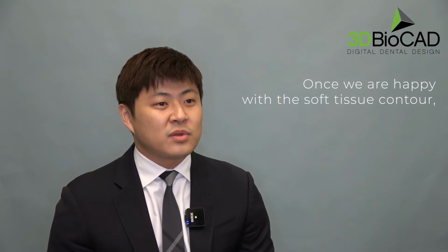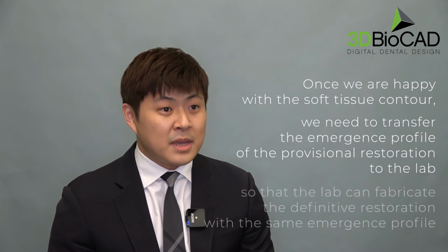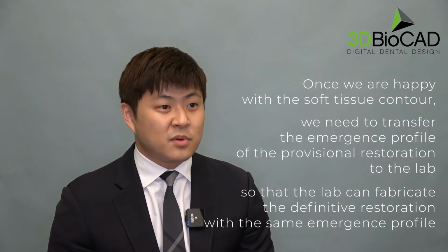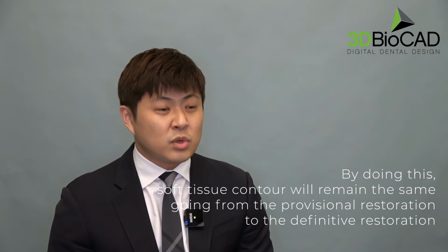And if the gingival margin position is not ideal, then we can alter the emergence profile, and in turn, this will alter the peri-implant gingival margin position. And once we're happy with the soft tissue contour, then we need to transfer the emergence profile of the provisional restoration to the lab so that the lab can fabricate the definitive restoration with the same emergence profile. By doing this, the soft tissue contour will remain the same going from the provisional restoration to the definitive restoration, which is really important in the aesthetic zone.